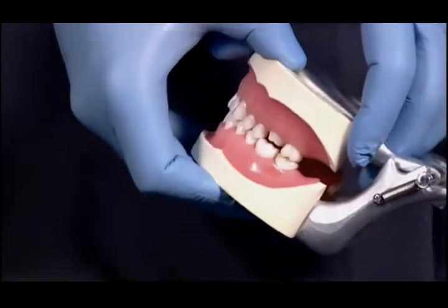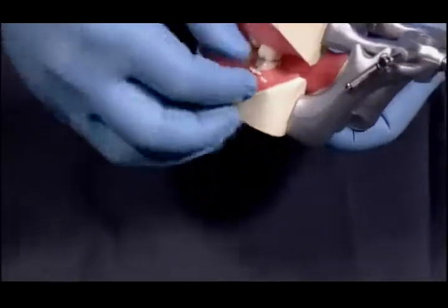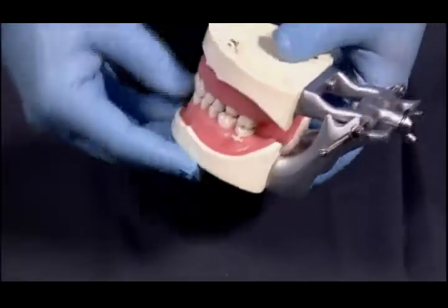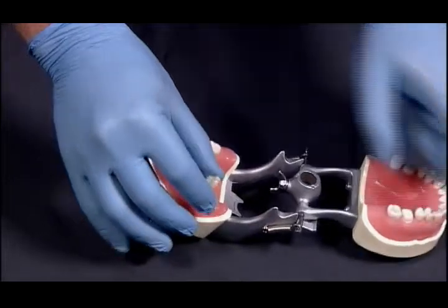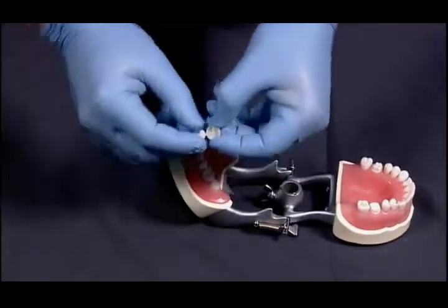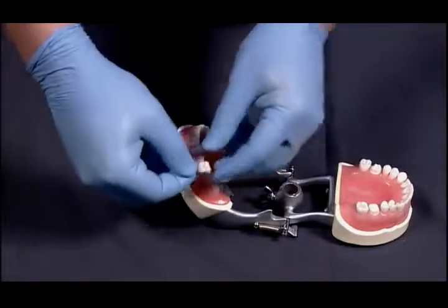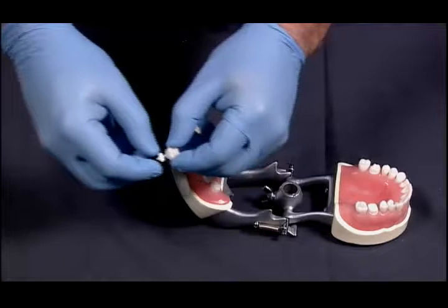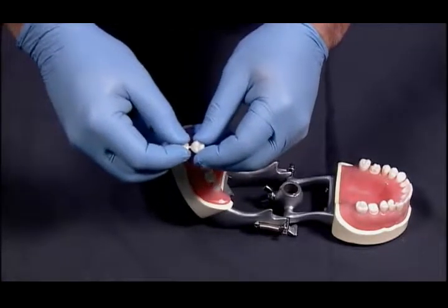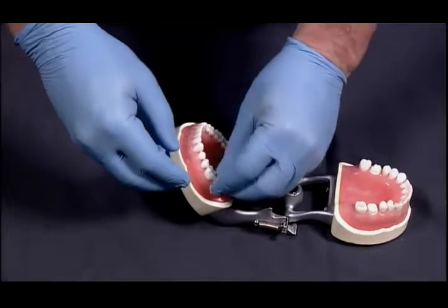making sure you can get the patient into maximum intercuspation. If you can't, what you're going to do is trim the polycarbonate crown shell and take it so that it's adapted, shorter on the walls, wider if you need more room on the interproximal, but you're going to cut the tab off from that particular temporary crown shell to be able to make it fit passively onto the tooth.